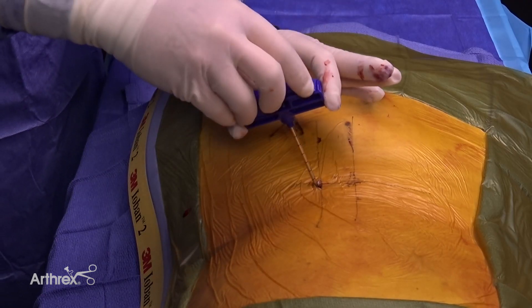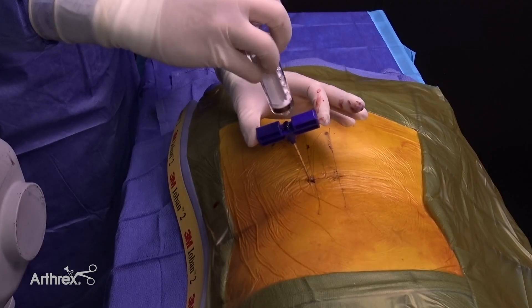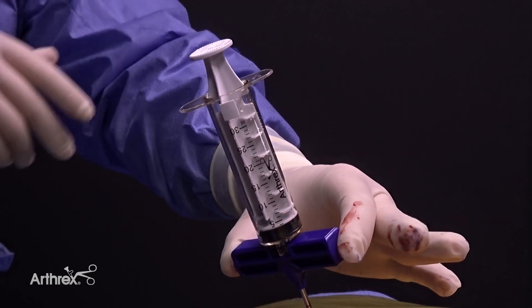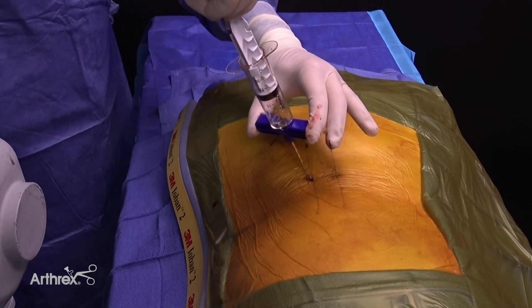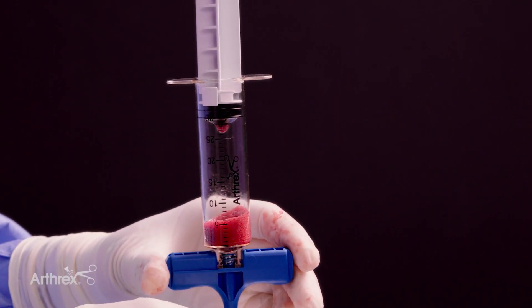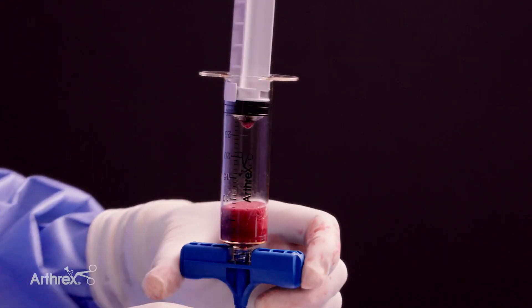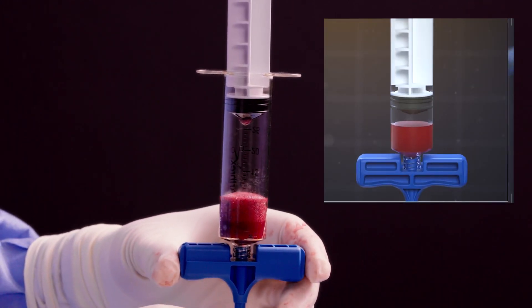The inner stylet of the needle is removed. You can clearly see the aspiration holes visible at the distal tip of the needle. The vacu-lock syringe is attached to the luer lock on the top of the needle, making sure to hold the handle of the needle in your opposite hand to keep it from moving while the syringe is being attached. Stabilize the needle with one hand and pull back on the plunger of the vacu-lock syringe with the other, twisting in a counter-clockwise motion at the top to set the vacuum. As the syringe begins aspirating bone marrow, we recommend changing the depth of the needle after every two cc's of aspiration to maximize the concentration of osteoprogenitor cells collected. This is done by alternating between half turns and one and a half turns of the needle.